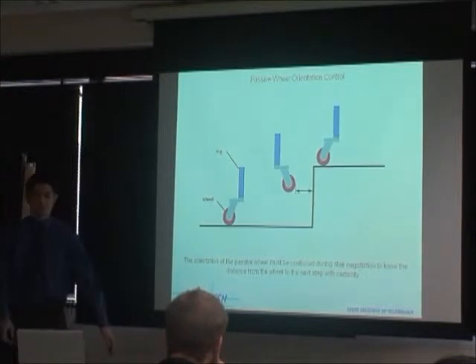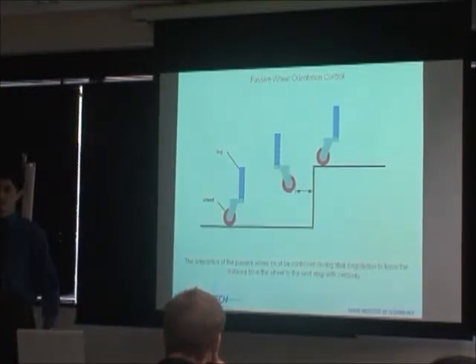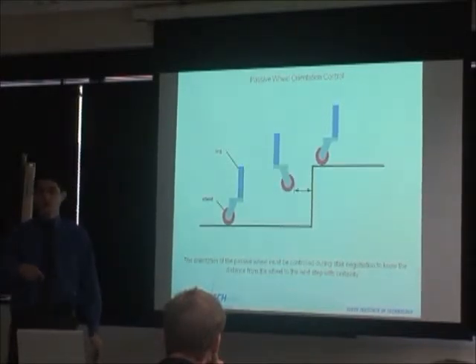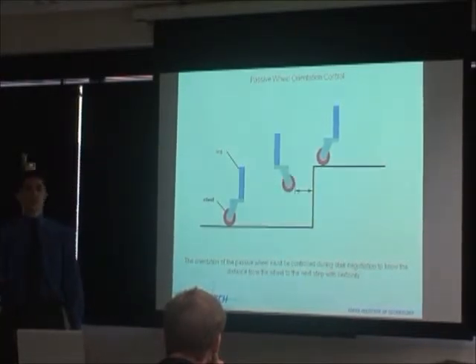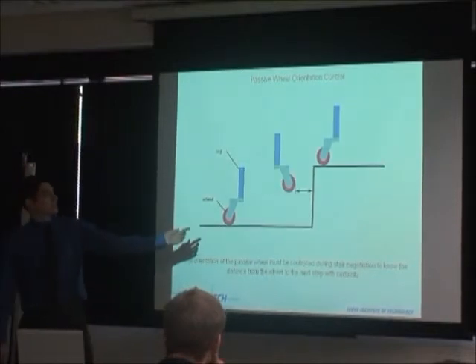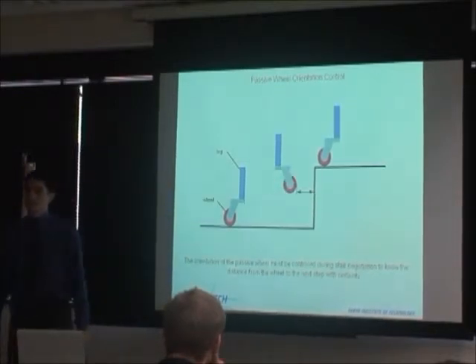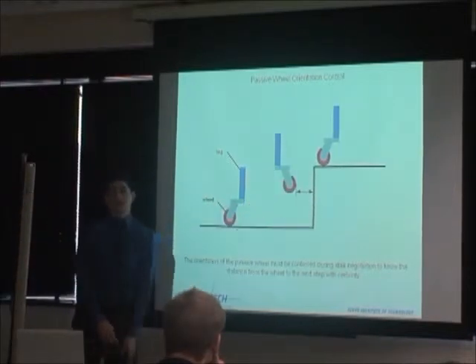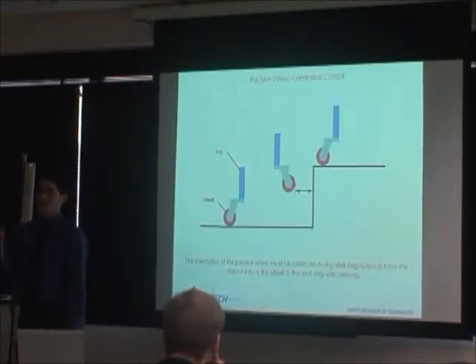Next, I'll talk a little bit about the passive wheel. I mentioned there are 4 passive wheels on the vehicle. Normally, just a regular passive wheel that can rotate 360 degrees would be sufficient, like on a wheelchair. However, in this case, we have to raise the wheels as we climb up the stairs. What happens when we do this is that this passive wheel is allowed to rotate while the leg is raising.